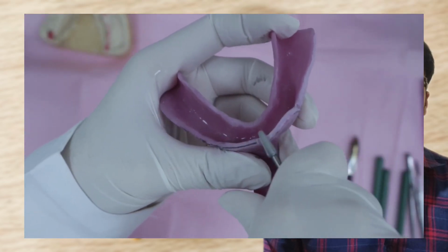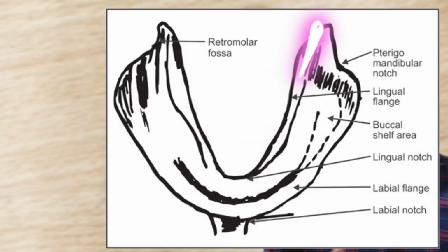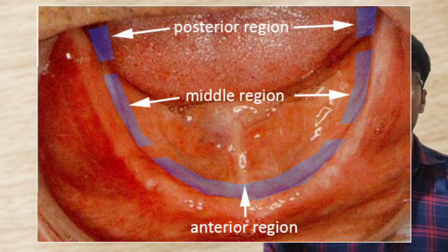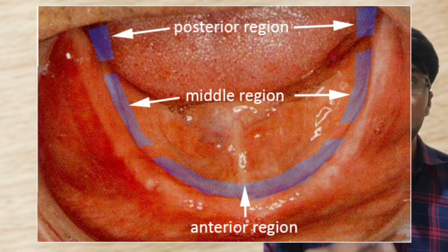Now start the border molding. Get proper hot water and a burner. Start with the lingual flange. To record the lingual flange, we first have to understand the anatomy of the lingual flange. The lingual flange can be considered in 3 regions: anterior, middle and posterior.